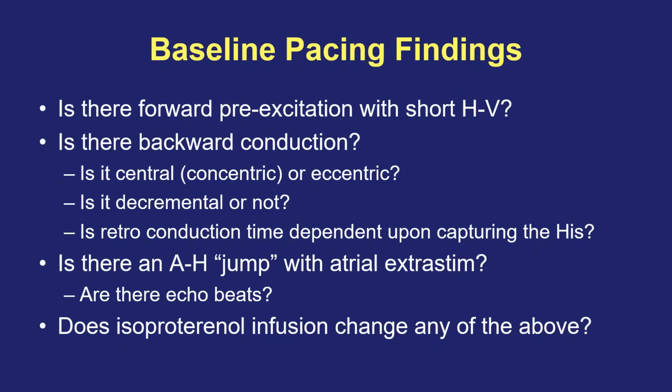And now comes the really fun part of the EP study, which is the induction of tachycardia and figuring out what is the mechanism. You've come to this point having figured out how the heart is wired. You know if there's an accessory pathway present or not, whether there's dual AV node physiology, or both perhaps. But when you induce tachycardia, it doesn't necessarily mean that the findings until this point explain the tachycardia.